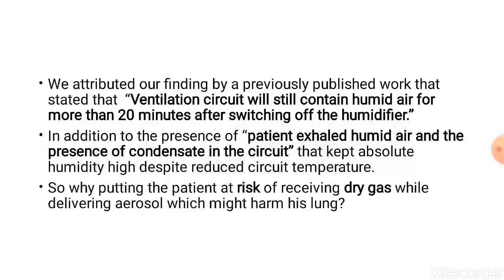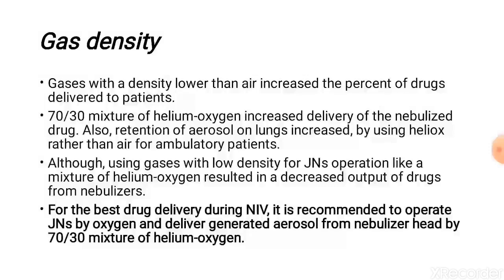So why switch off the humidifier while delivering it? It's just risky to the patient for no reason at all. The gas density: the lighter the gas, the better the delivery. When you use a mixture of helium and oxygen, 70-30, it delivers much better than oxygen.